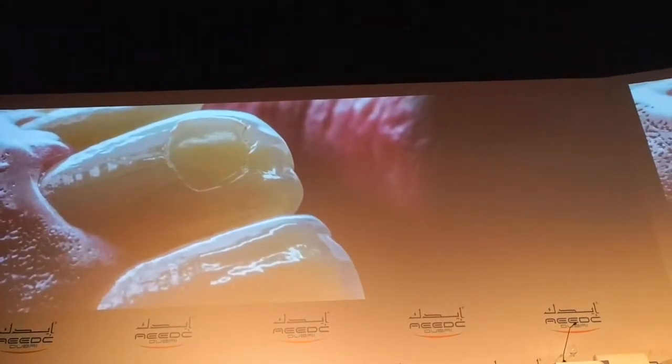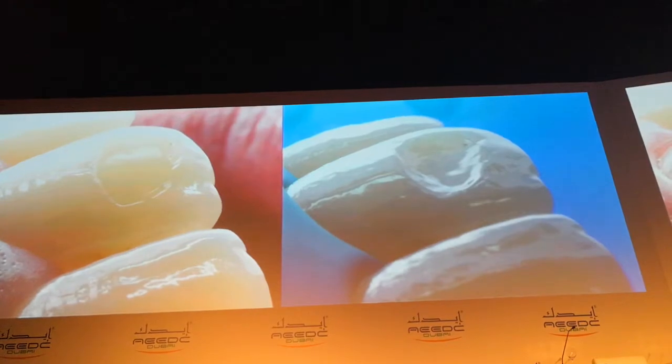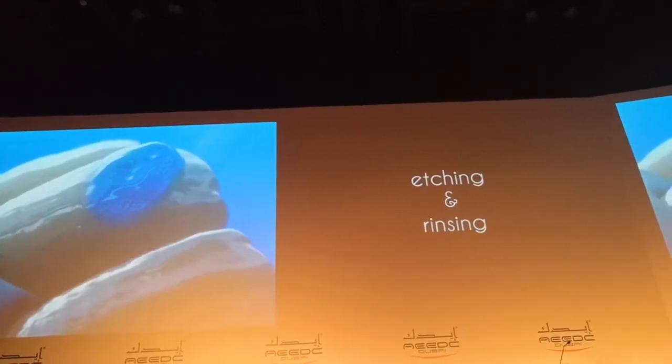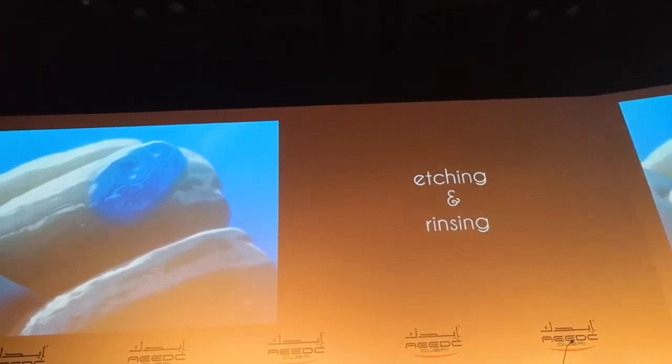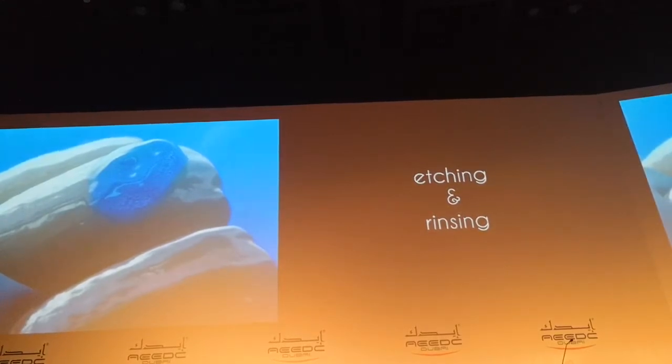In this case I just removed all composite carefully. And then after removal of this composite it needs to be etched. Maybe this etching — it was from 2015 or 2014. Maybe I need to etch a little bit more because not to have the discoloration. I should admit that. And then after etching it needs to be rinsed.